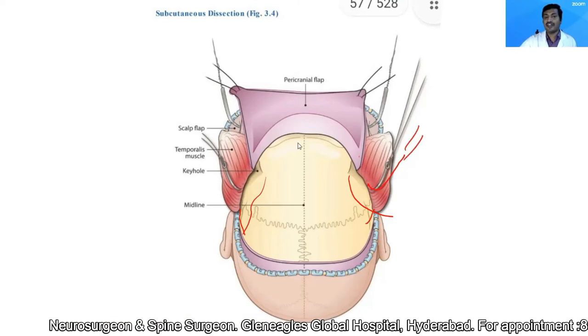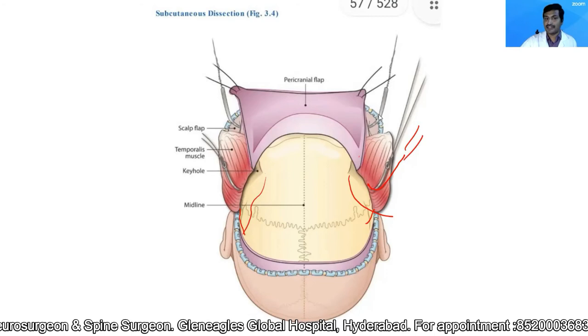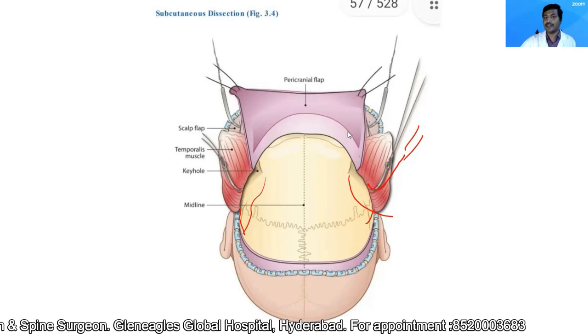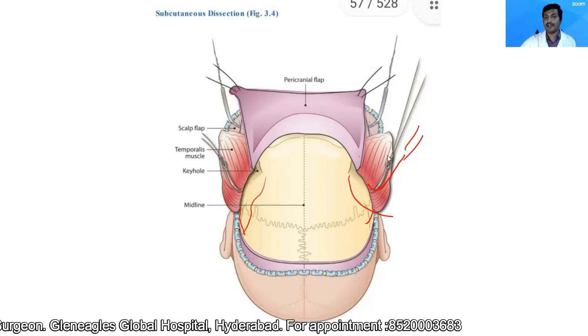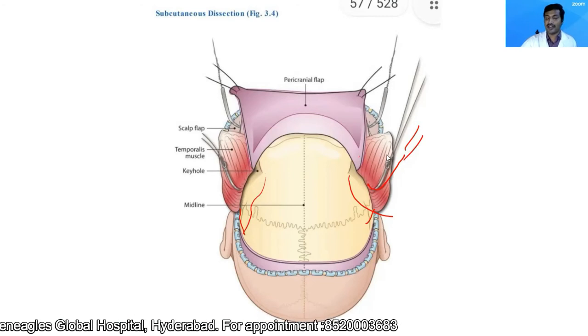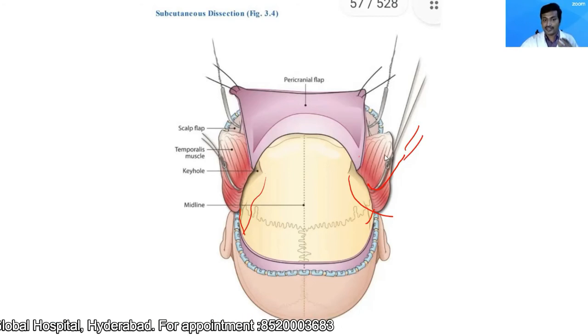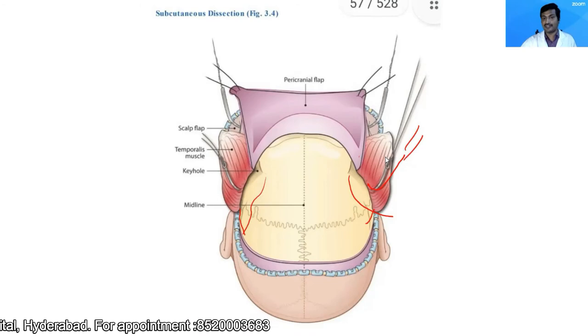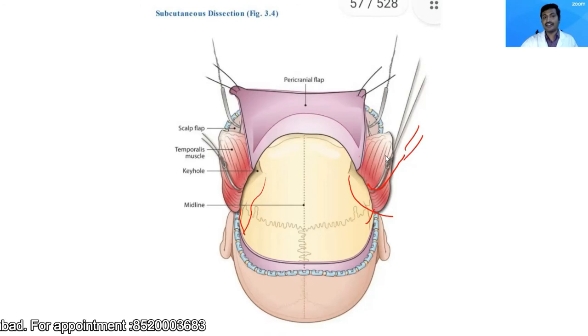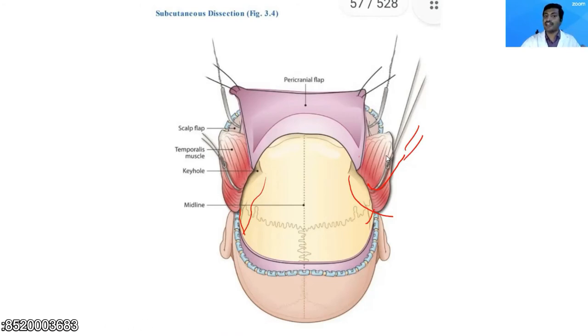Whenever I reflect a flap — whether skin, pericranial, or temporalis — I use gauze rolls so that the reflection does not kink the blood supply.